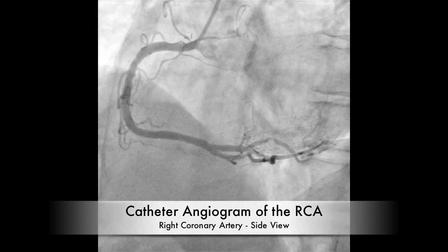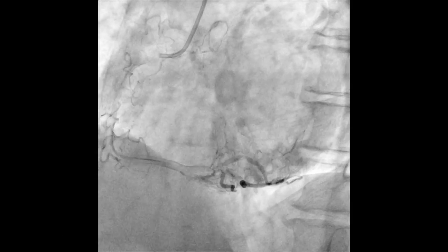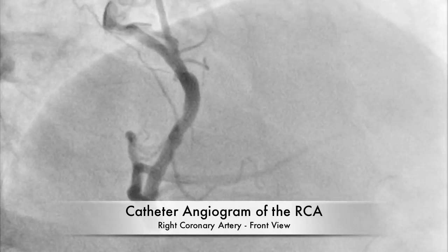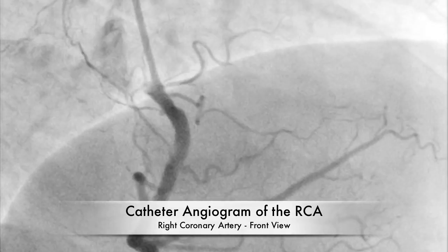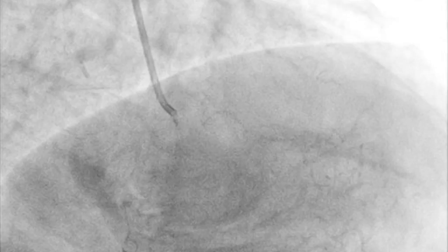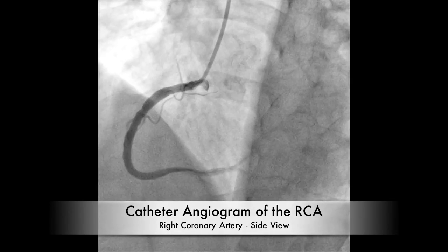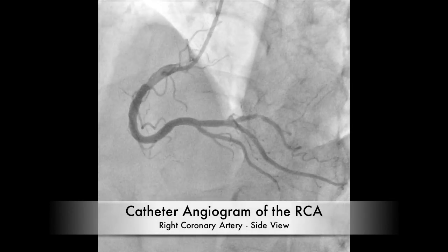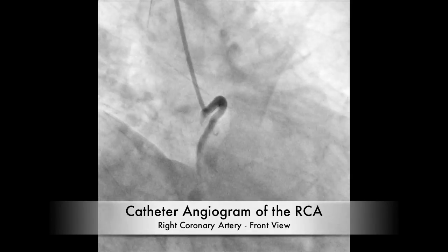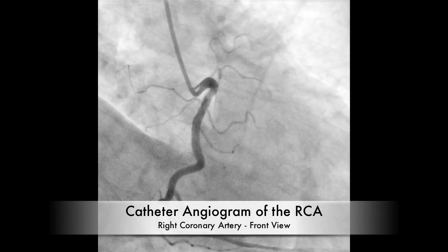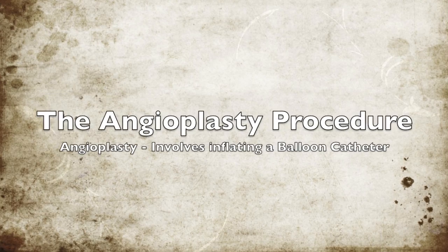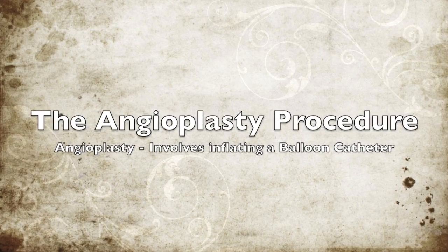The catheter angiogram of the RCA — here is the side view, and now we see the front view of the RCA before stenting. In the side view, you can see that the top branch is kind of crimped — that is a blockage that is 75% blocked.